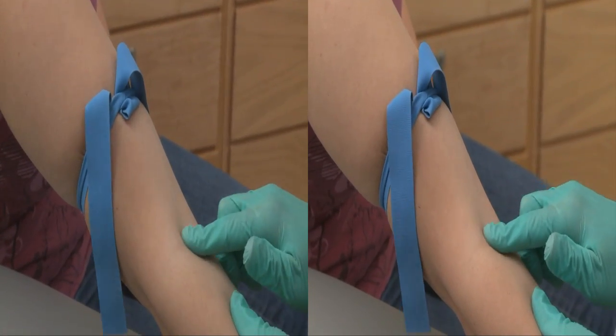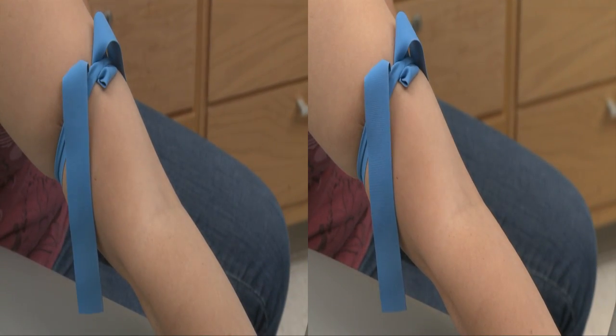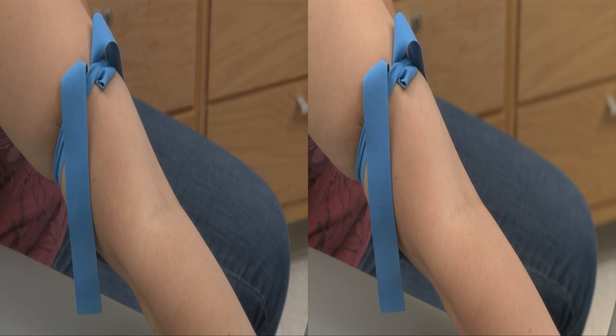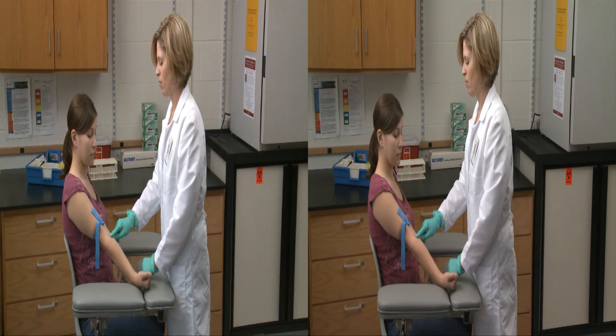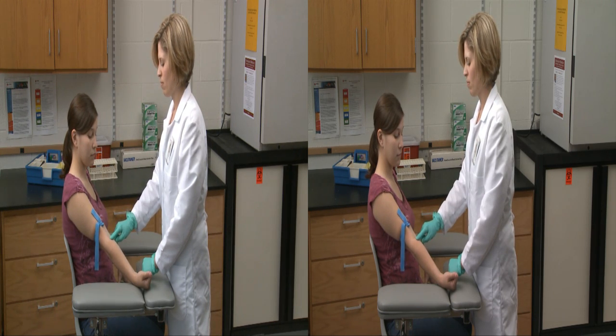Use your fingertip to palpate the antecubital fossa to locate the median cubital vein. Palpation helps determine the direction of blood flow in the vein, to gauge the vein's size and depth, and to estimate its tendency to roll. It also helps differentiate veins from arteries. Unlike veins, arteries have thicker-feeling walls and are more elastic to the touch.